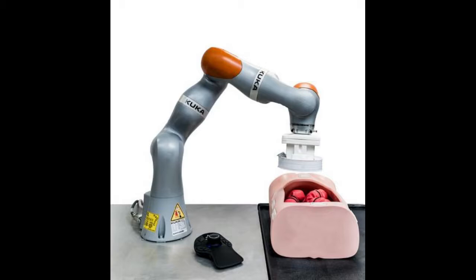Robot-assisted colonoscopy has the potential to revolutionize the way the procedure is carried out. It means people conducting the examination do not need to be experts in manipulating the device. That will hopefully make the technique more widely available, where it could be offered in clinics and health centers rather than hospitals.